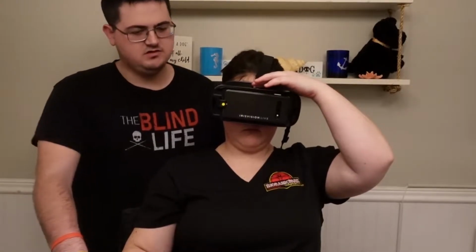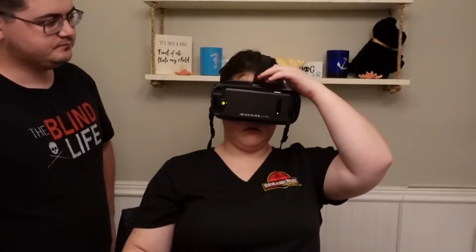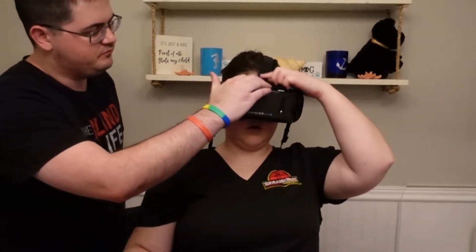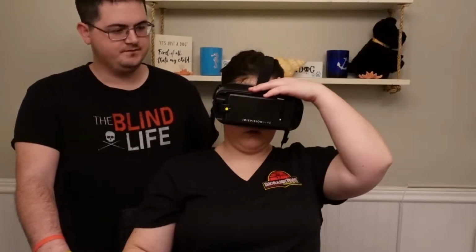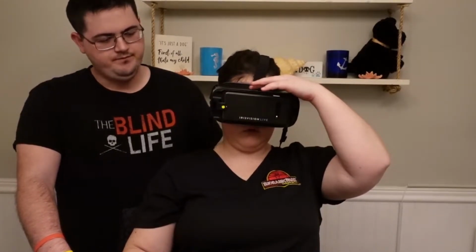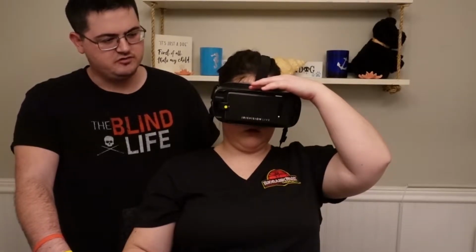Yes. To focus, you would start by putting it as far left as possible. It's a little knob at the top. Right up here. Yep, there you go, you got it. Kind of like a pair of binoculars. Exactly. And you would slowly move that left or right just to get that focus just right for you. So play around with that a little bit, Lexi. Tell me when you think you like it.